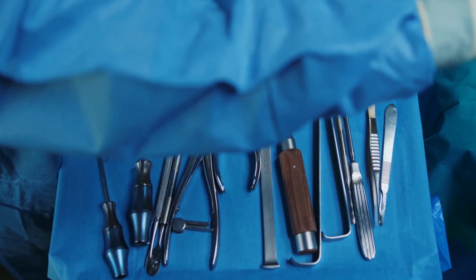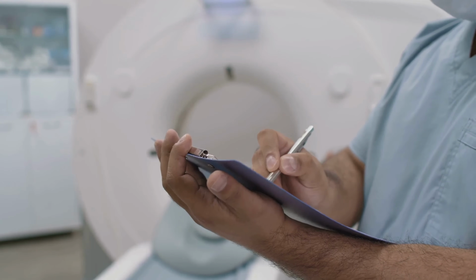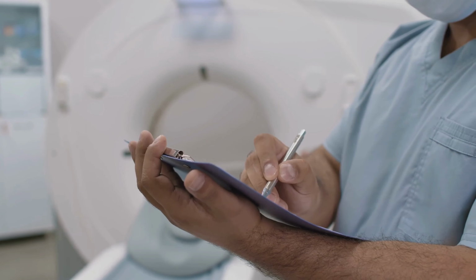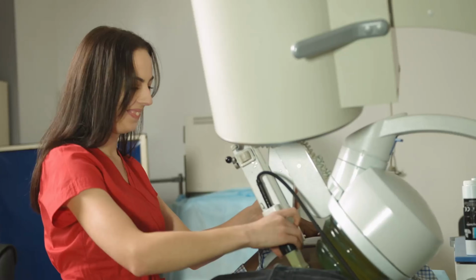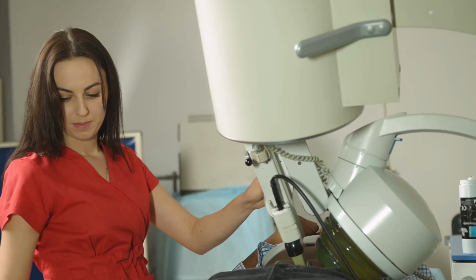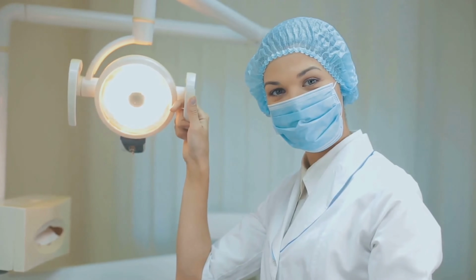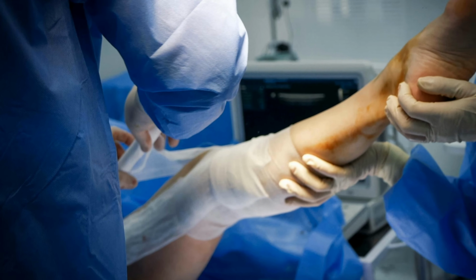Preparation varies depending on the type of cystoscopy patients are having. There are two main types: flexible cystoscopy, which uses a thin, flexible tube with a camera and is typically used for diagnostic purposes. On the other hand, rigid cystoscopy uses a straight, non-flexible tube with a camera and is often used for treatment procedures. For a flexible cystoscopy, it's typically done with local anesthesia, and the patient can eat and drink normally on the day of the procedure.